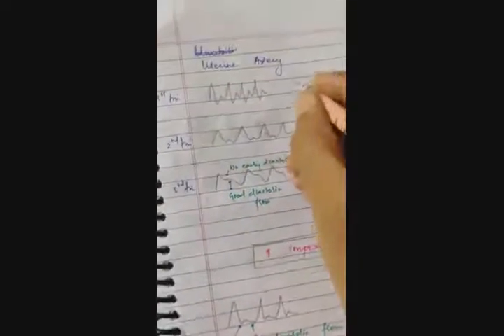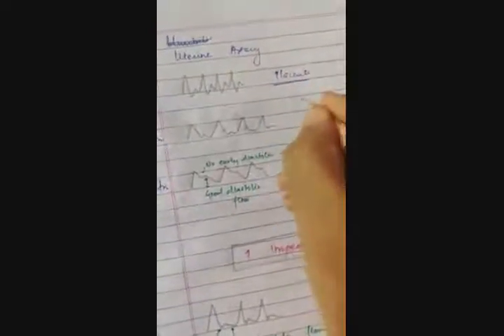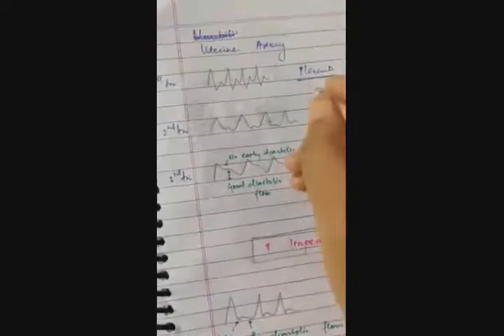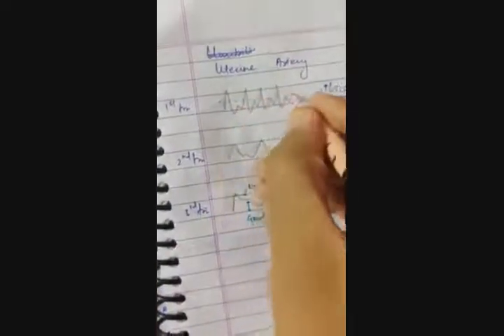This is the uterine artery. This is the umbilical artery. During the first trimester, the placenta is just forming. The uteroplacental flow is just beginning to develop, which is why it's a high resistance circuit. That is why the triphasic flow that we just studied is being followed here. Alright, the mean forward flow through the uterine artery would be somewhat here.